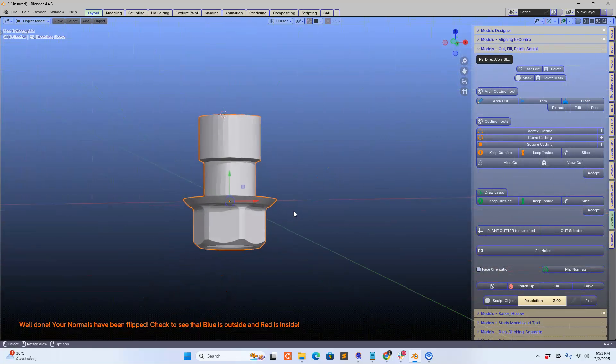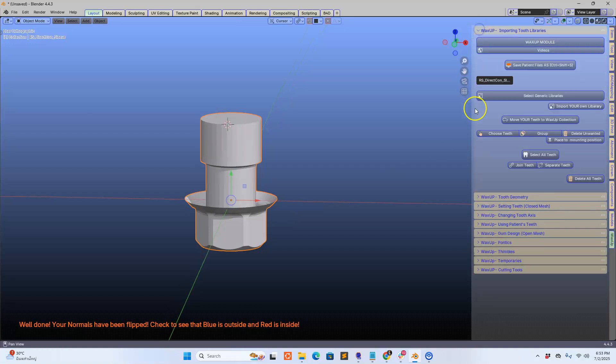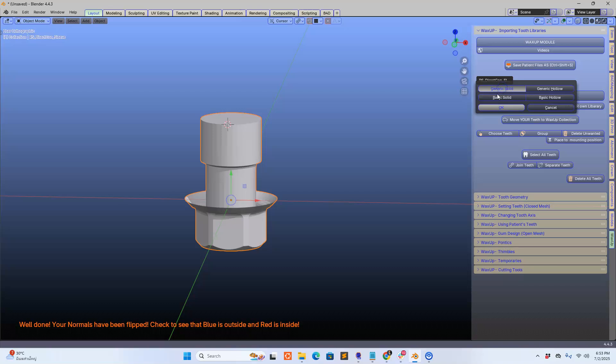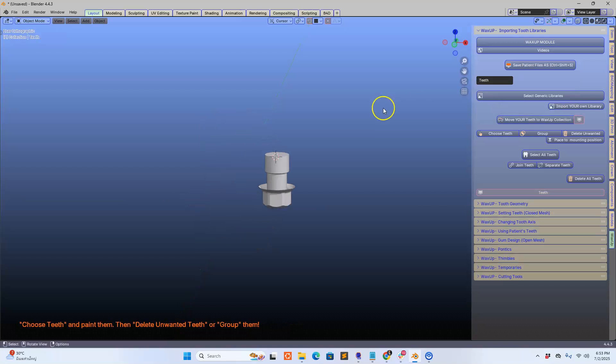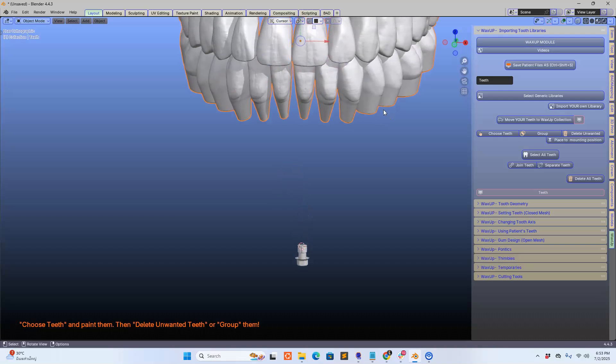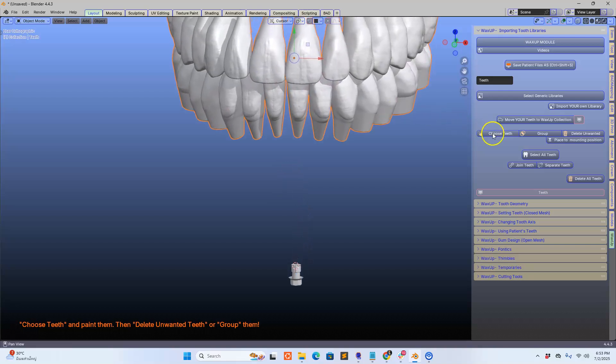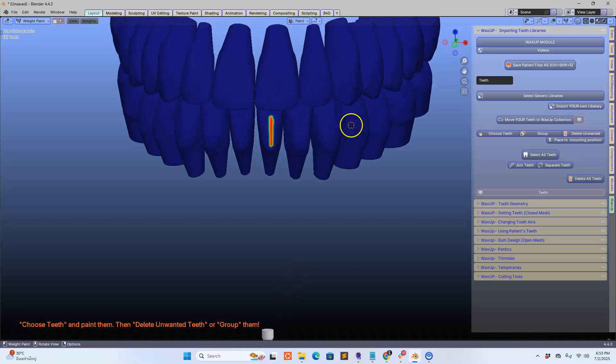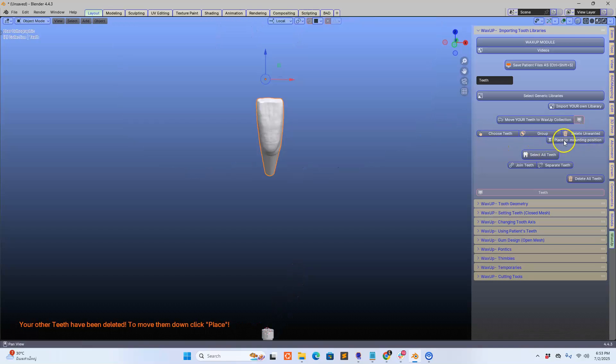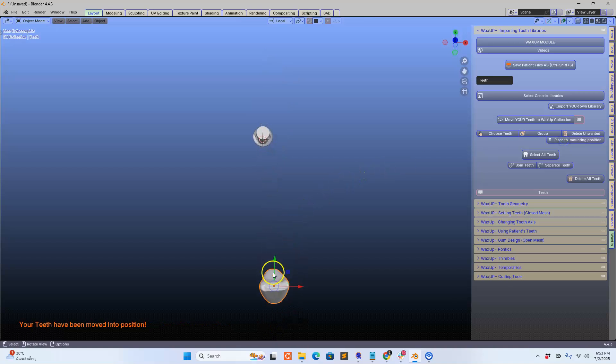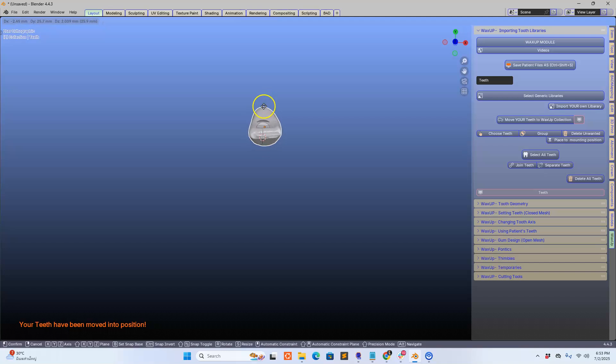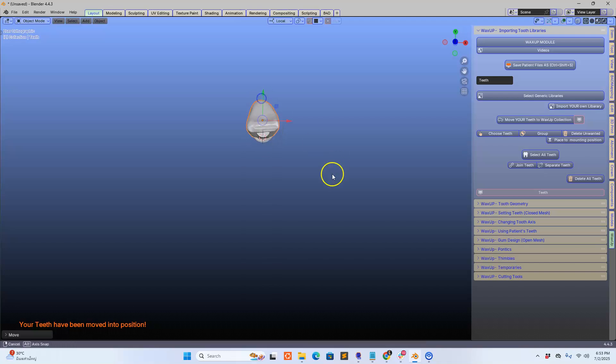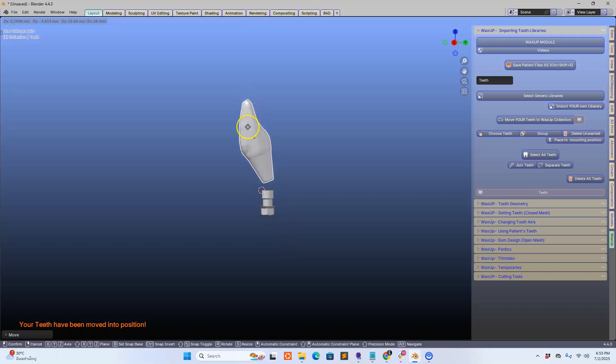Then we're going to get a wax up tooth. In the wax up module I'm going to get it from the generic and I'm going to try and get a skinny tooth just to make it as difficult as I can for myself.